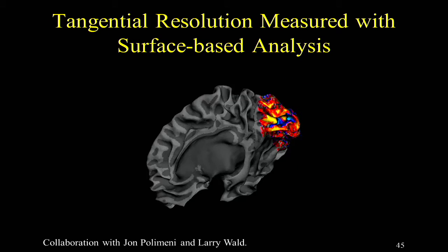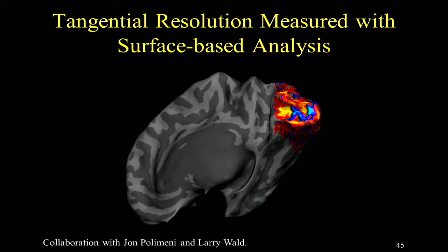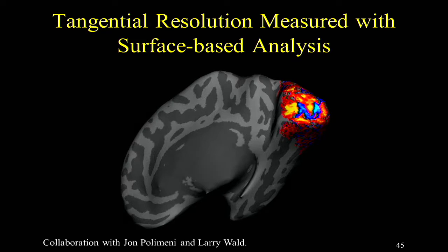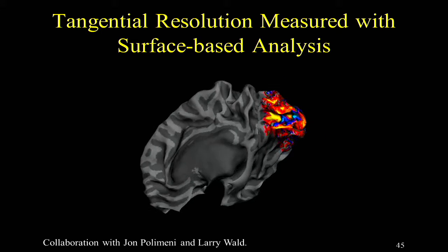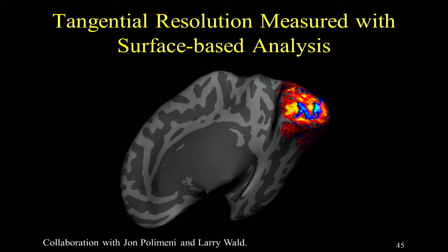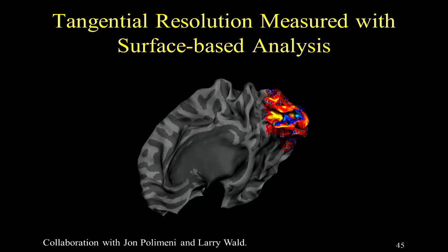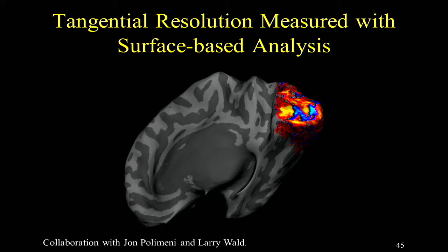This is really the motivation for why we want to generate cortical models, and why, if you're doing functional or molecular analysis of cortical properties, you really want to use a cortical coordinate system with the anatomical models. Even if the anatomy is utterly uninteresting to you, which it is to most people, having access to the models of the anatomy enables you to do this type of analysis. This very simple pattern is lost in the arbitrary slices in which I typically acquire and visualize my data.